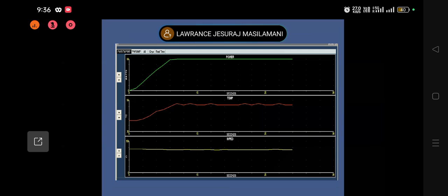When you are not properly in contact, sometimes your power oscillates. You will see you have programmed a power of around 50-60 watts, but you will be delivering 20, 30, 40, and it will be changing all the time. That means you are not in proper contact. Make sure you give a proper contact and get a good, sustained power. The temperature settings, most of the time we keep more than 50 because you want to give an irreversible damage.